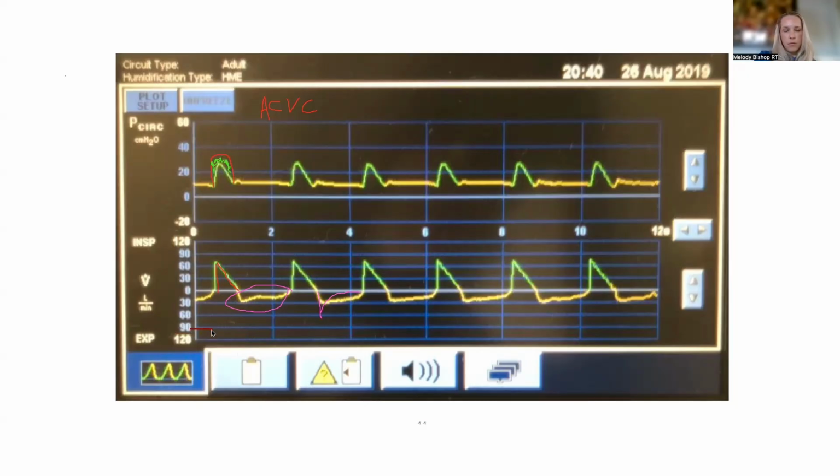Like maybe it drops, drops, drops, and then maybe it lessens a little bit because you don't see as much of a deflection upwards, whereas the patient's trying to pull up to trigger a breath. It's just that throughout this whole expiratory flow, it's not as deep as you would think. So as you mentioned, the patient's working throughout this whole expiratory phase, like they're not in full expiration.